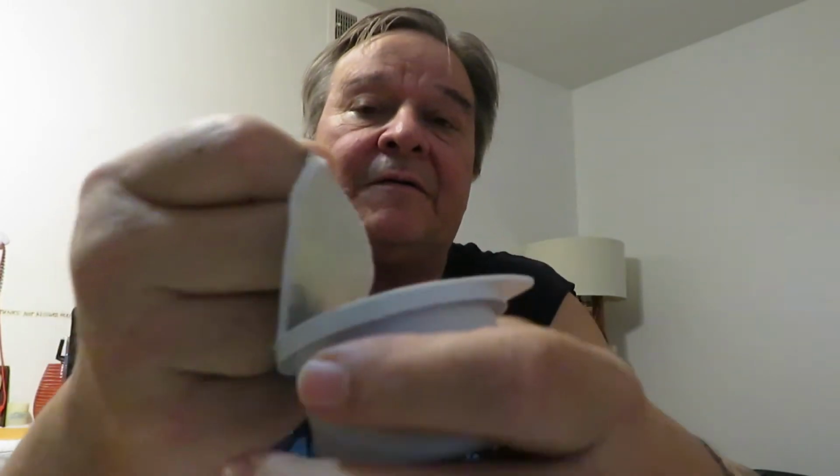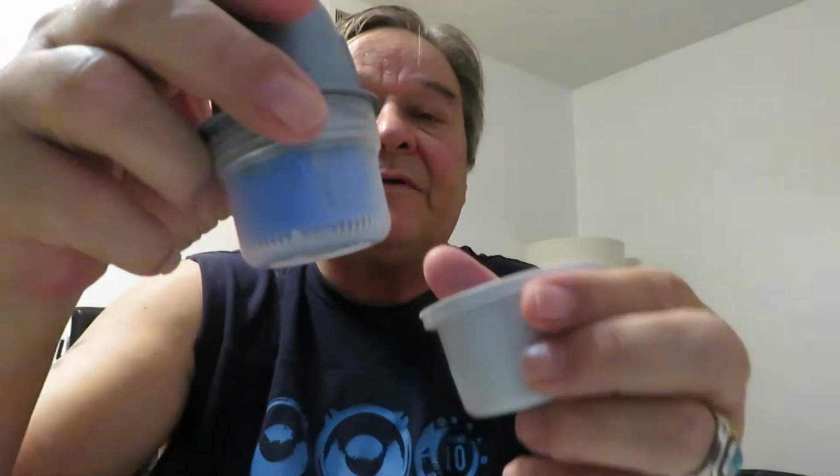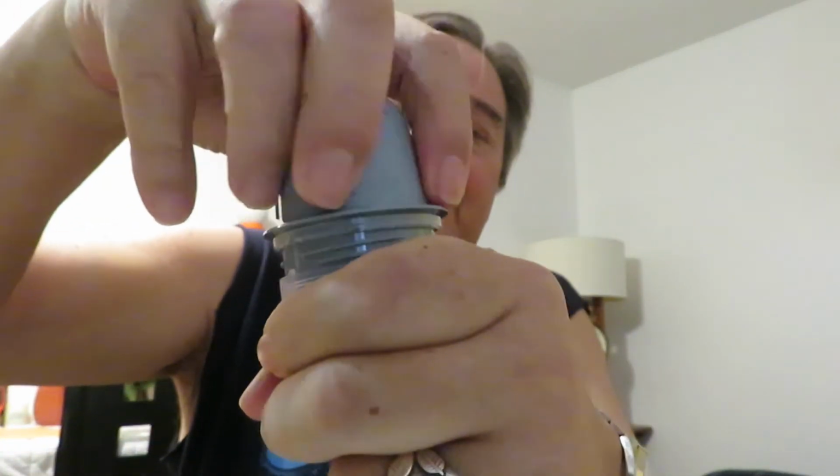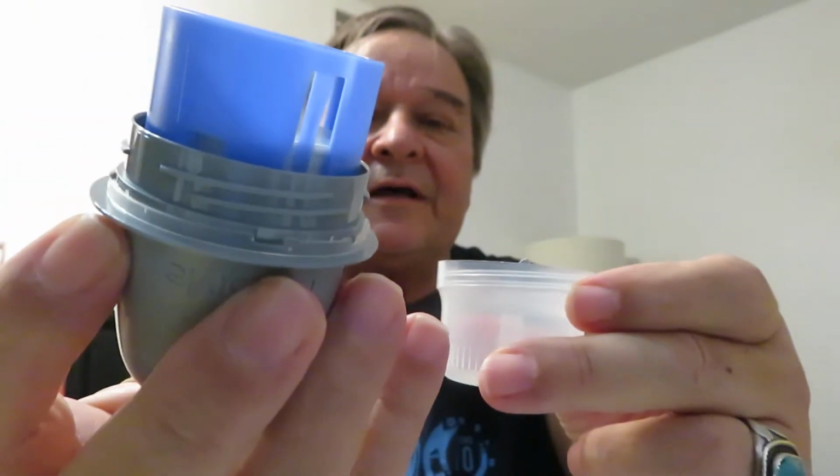Let's see. It was good there before. Wipe it off with the alcohol swab. And like I said, it's got the jello gelatin thing or pudding thing, you want it really sticky on there good. Then I got this. Unscrew it. This should be easier because I was unscrewing it the wrong way before. And now, see, it helps. Just a lid.